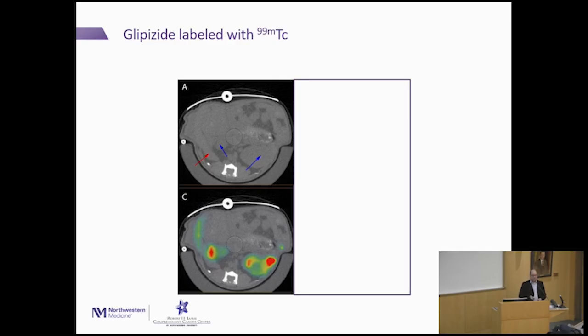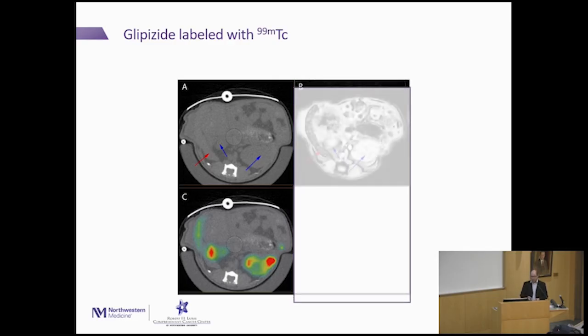And this collaborator was trying to develop an imaging agent to image the pancreas. And when he saw this, it's shaped similar to the pancreas. It's near the kidney, so it's in the right location, sort of. And so he got excited and he said, well, it looks like this is working. And I said, well, we really should do MRI because there's better soft tissue contrast.